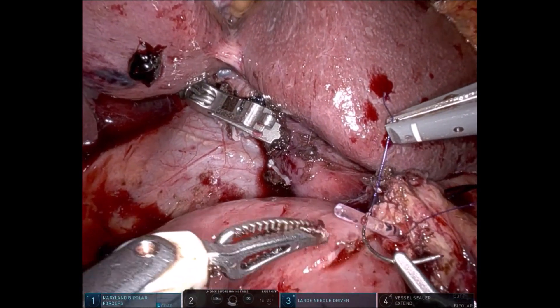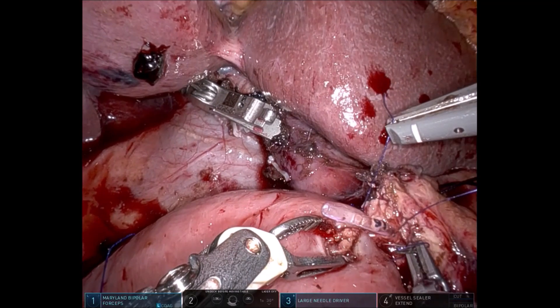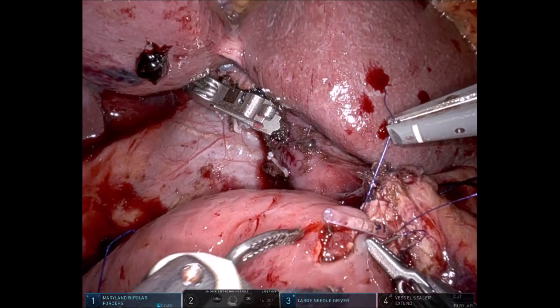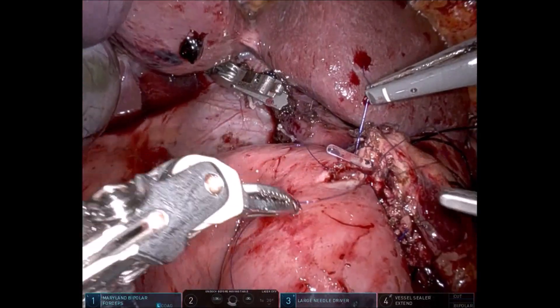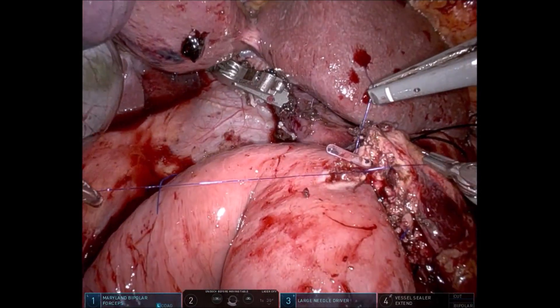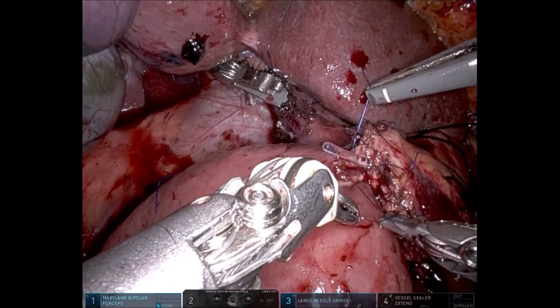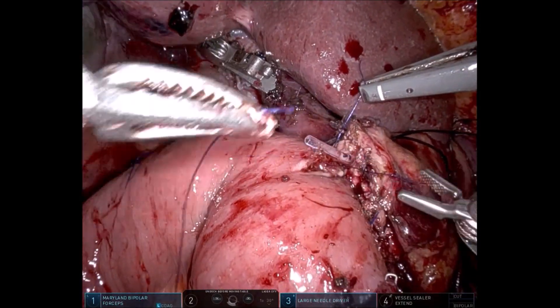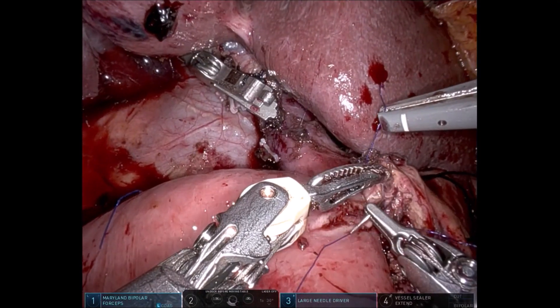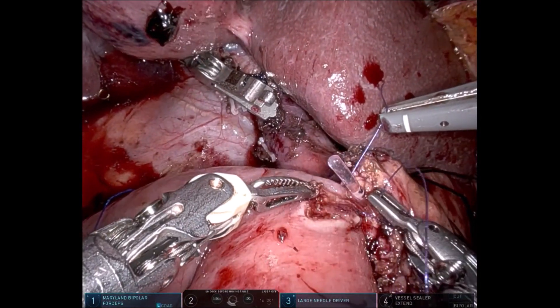The next bite is taken at the 6 o'clock or 5 o'clock position. As we can see, the serosal incision of the jejunum is bigger than the mucosal incision, but we ensure that a duct-to-mucosa suture is being taken. Two sutures are placed — one at 8 o'clock and one at 5 o'clock. By retracting these two sutures, we take another suture in between, at approximately 7 or 6 o'clock position.